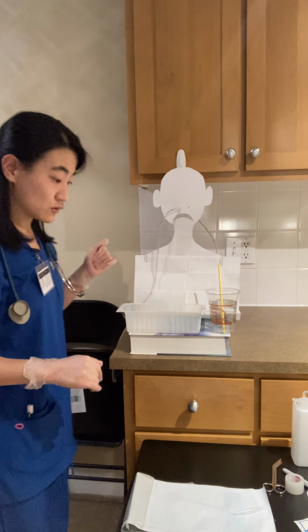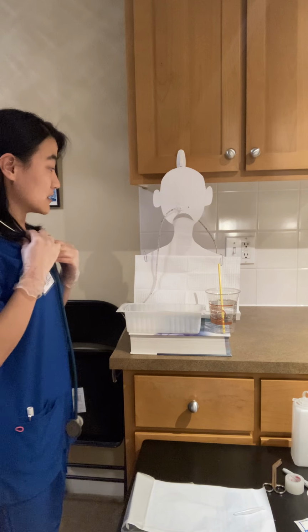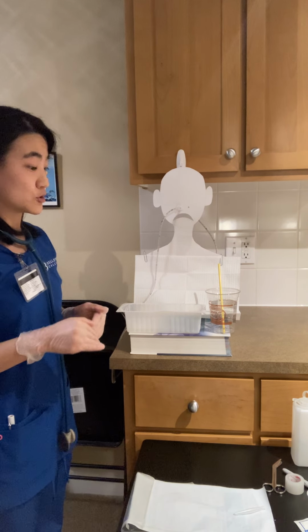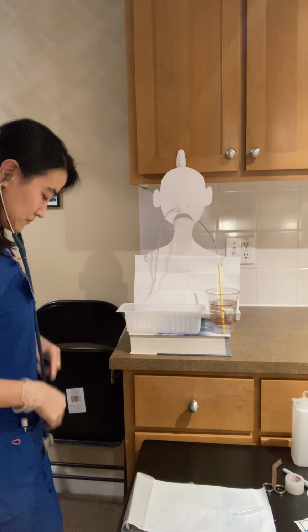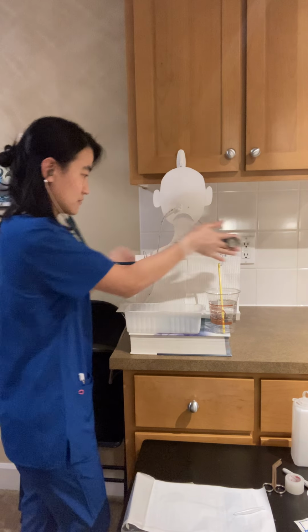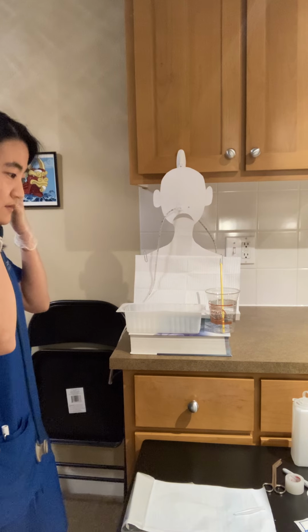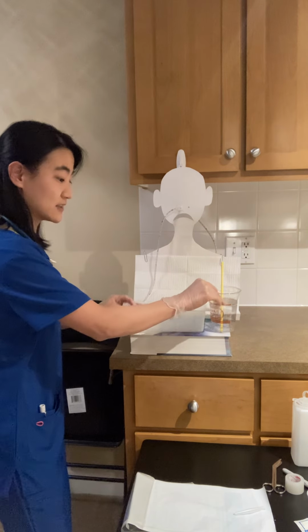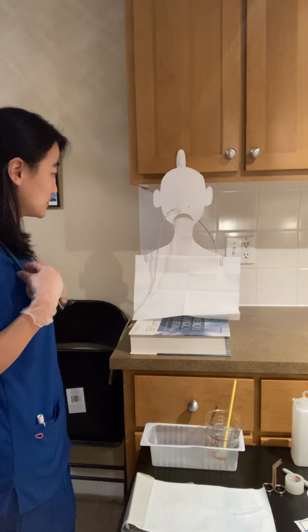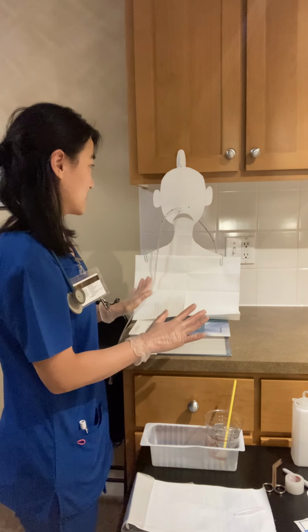And then once I have that anchored, I am going to go through a few assessments just to confirm the placement of the tube. So first I am going to auscultate his lung sounds again to make sure that there haven't been any changes in his lung sounds that might indicate that the nasogastric tube has actually gone into his lungs. And before doing that, I probably should have taken these away first. So I'll just make a note that those shouldn't have been there.